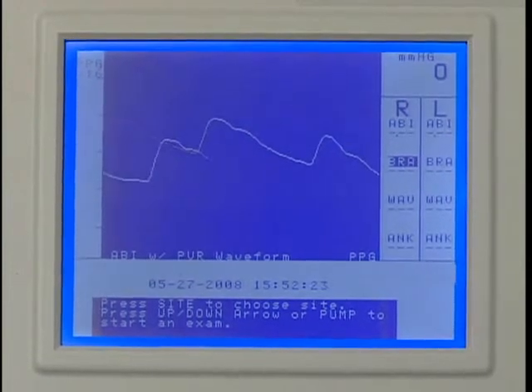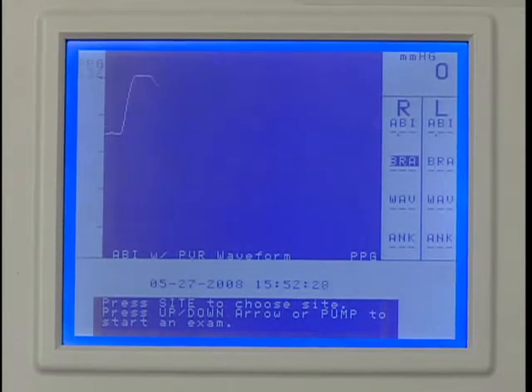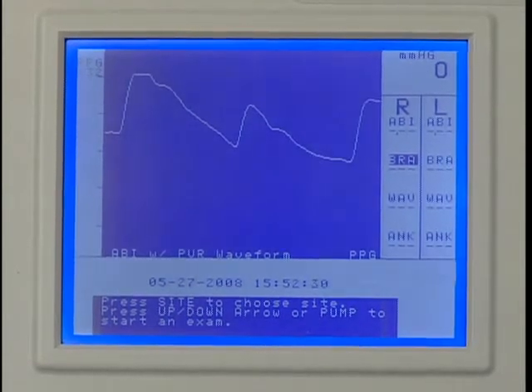Wait a few seconds for the waveform to stabilize after applying the probe. Press SCALE one or more times as needed to adjust the vertical scaling to obtain a waveform as large as possible without clipping at the top.